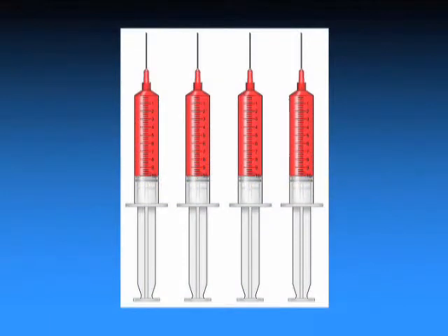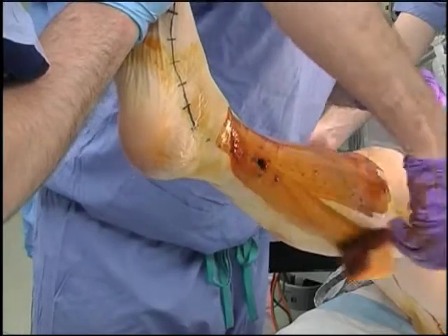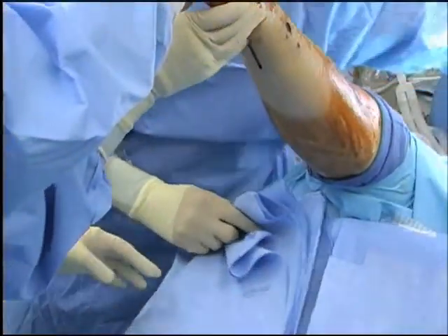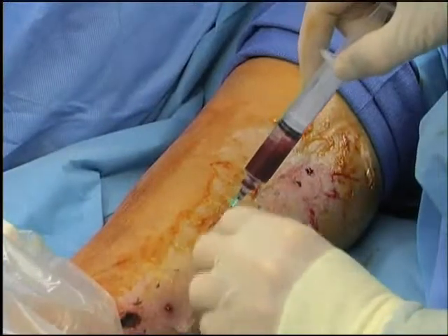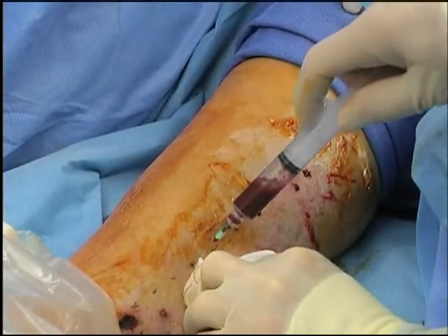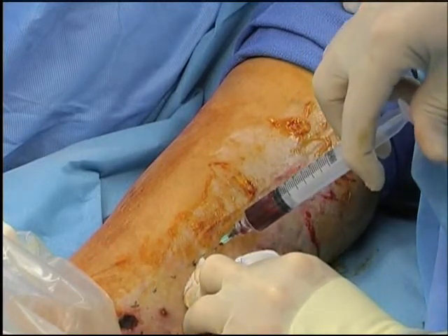4 10 milliliter syringes with needles will have been prepared and presented on the sterile field when the treating physician enters the operating room. All injection procedures are performed with sterile technique and full barrier protection. Injections into the calf will be made with a 21 gauge needle at a depth of 2 to 4 centimeters and should be performed using the Z-track method.